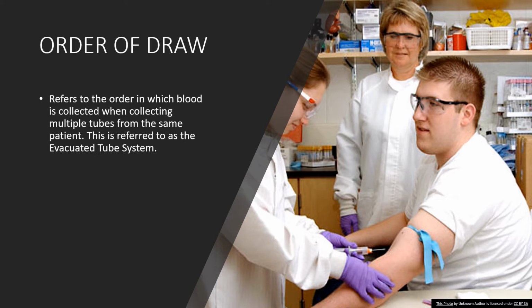You want to make sure that when that requisition is given to you or it prints out of a printer, and you have that requisition that tells you to draw a CBC and an electrolyte panel and a lipid panel, or whatever it may tell you that that doctor has ordered on that patient, that you make sure that the patient you're drawing that blood on has been properly ID'd and you are drawing the blood on the correct patient.